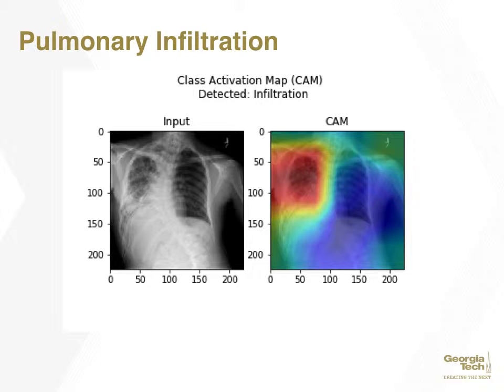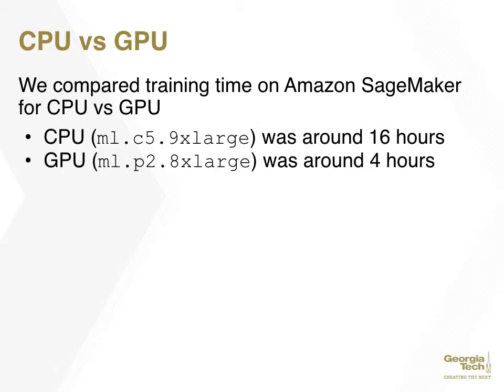Clear air shows darkly on X-ray images, and whiter areas indicate denser material. A pulmonary infiltrate is a substance denser than air, such as pus, blood, or protein, which lingers within the parenchyma of the lungs. This class activation heat map sharply highlights the entire right lobe for presence of infiltrates in red. In contrast, the left lobe is free of infiltrates and colored blue.